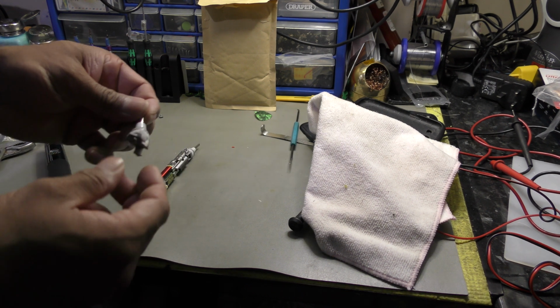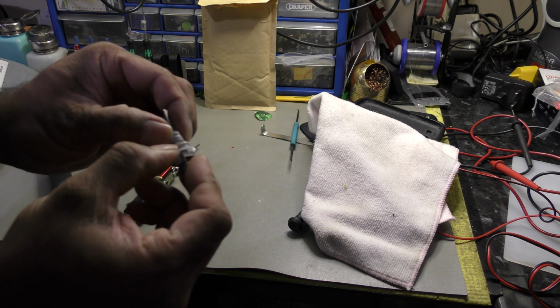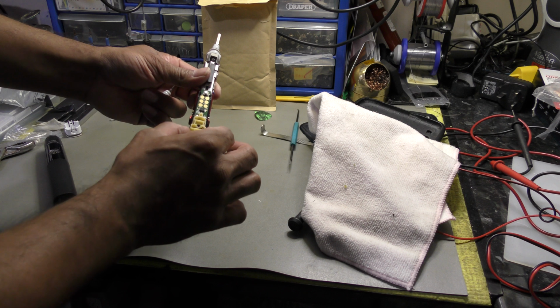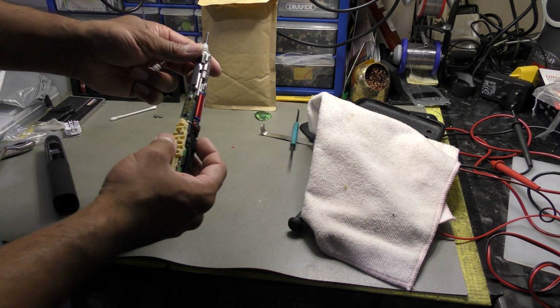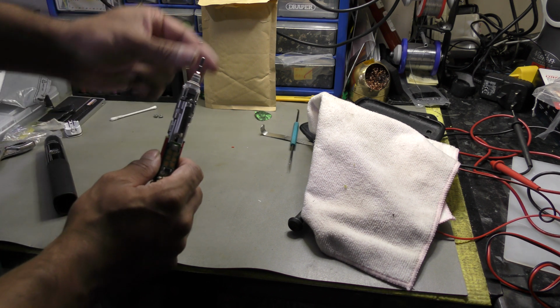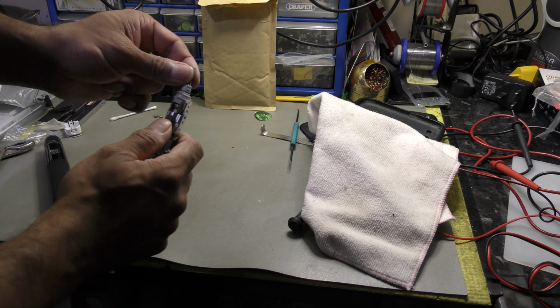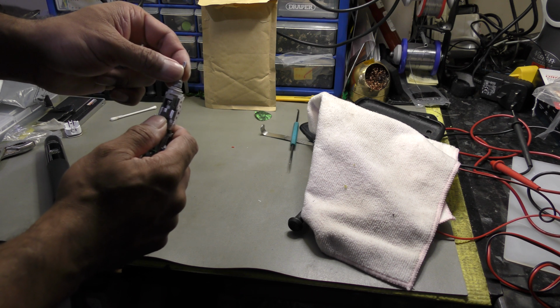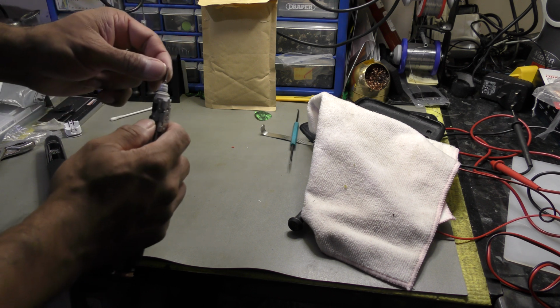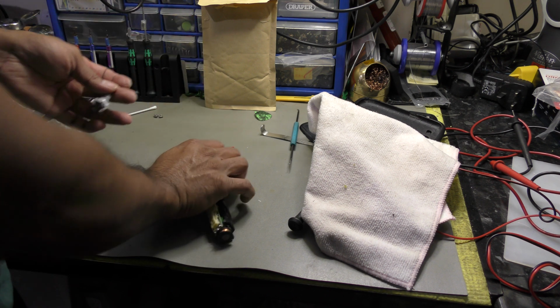Okay, so what's happened is this is the old unit. As you can see, that's all dirty. The seals have broken. Water hasn't come through, luckily. And the symptom of the unit was that when you put in the attachment on the brush itself and wiggle this bit, it sits in one position rather than coming back into a neutral position in the center. There's not any force feedback basically on this.